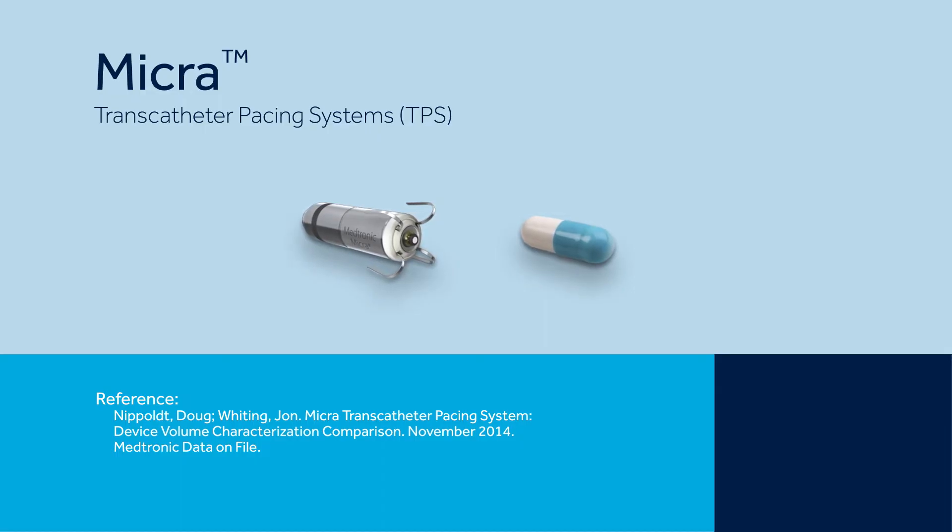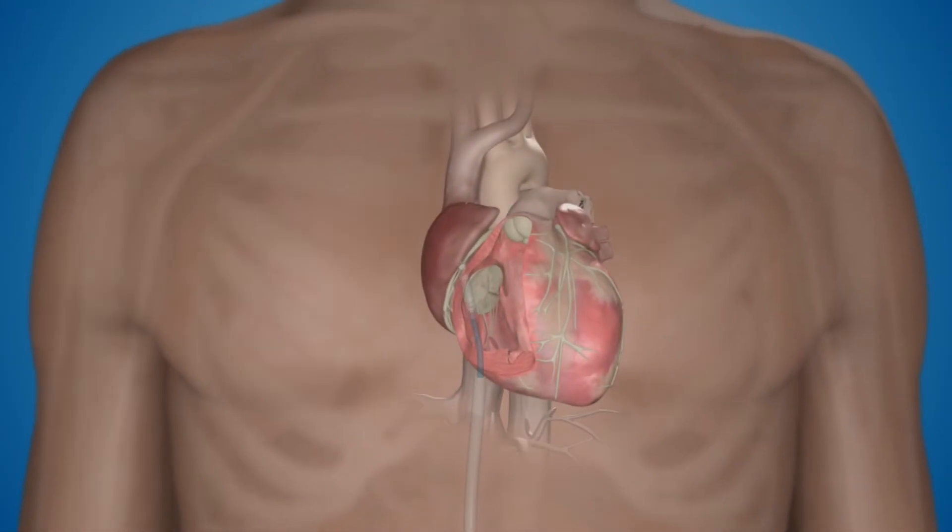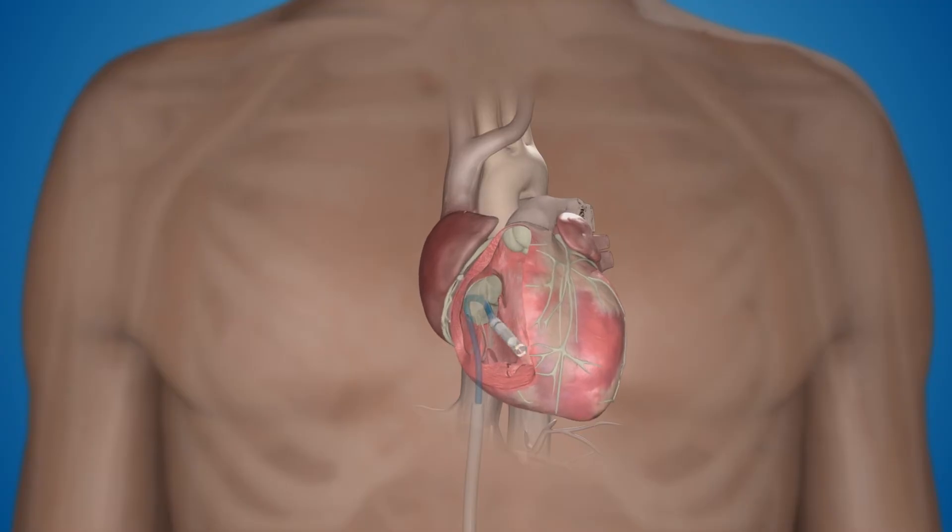Micra is small, but it paces just like a traditional pacemaker. Micra is implanted by a minimally invasive procedure, directly into the right ventricle of the heart.